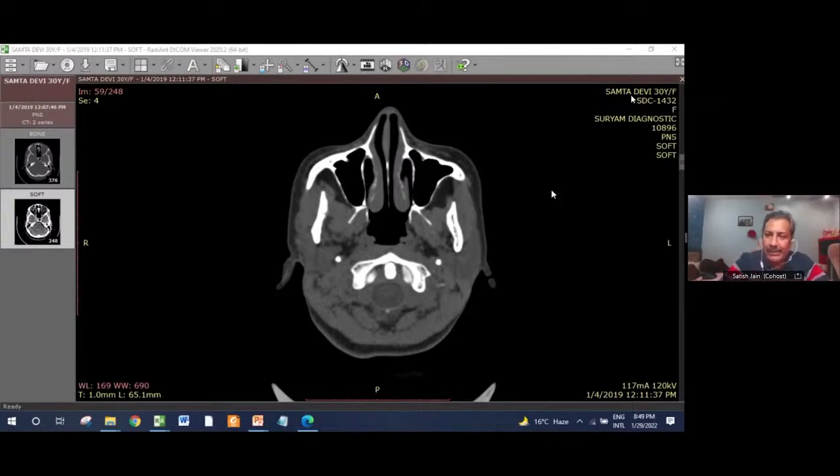The plain CT scan is adequate for giving you all bony details for a sinus surgery. Except sinus surgery, if you are getting a CT scan done, it should be contrast, like for the tumors. But for that, the MRI is the investigation option. Sometimes you get both MRI and CT scan, wherein the MRI gives you soft tissue details and CT the bony details. And you can club them together with a fusion system in your navigation as well.